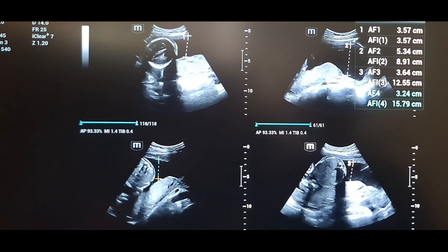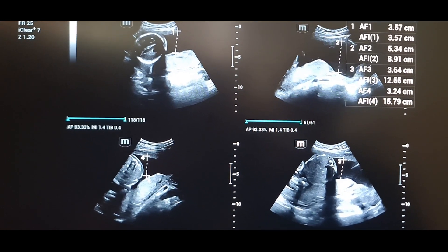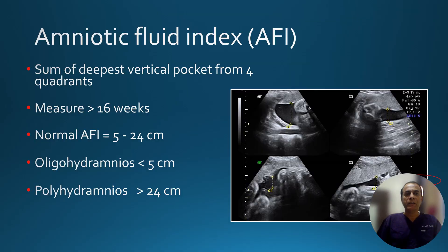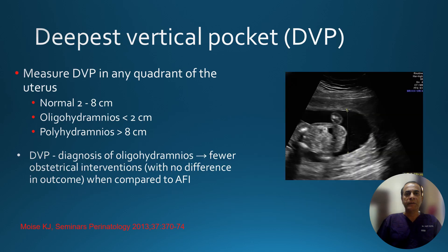Always follow a scheme so that you will not measure the same pocket twice. We measure the four-quadrant AFI. If the amniotic fluid index is between 5 to 24 centimeters, it is normal. If it is less than 5 centimeters, it is oligohydramnios, and if it is more than 24 centimeters, it is called polyhydramnios.